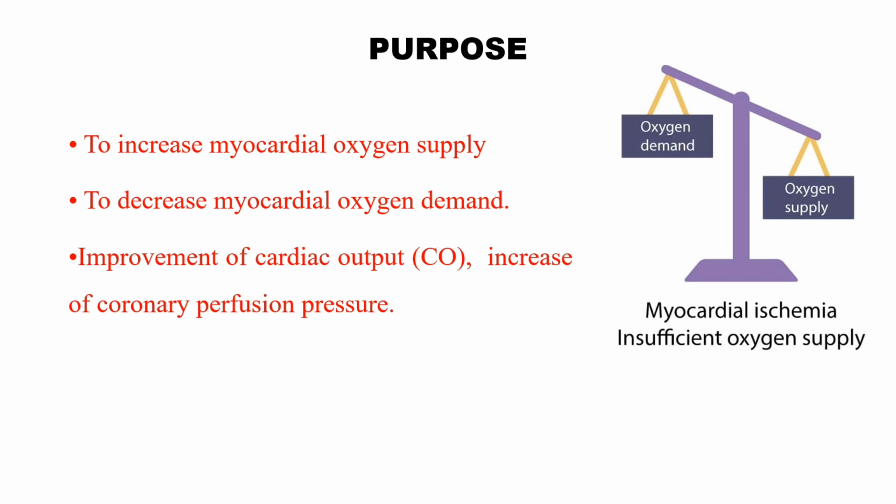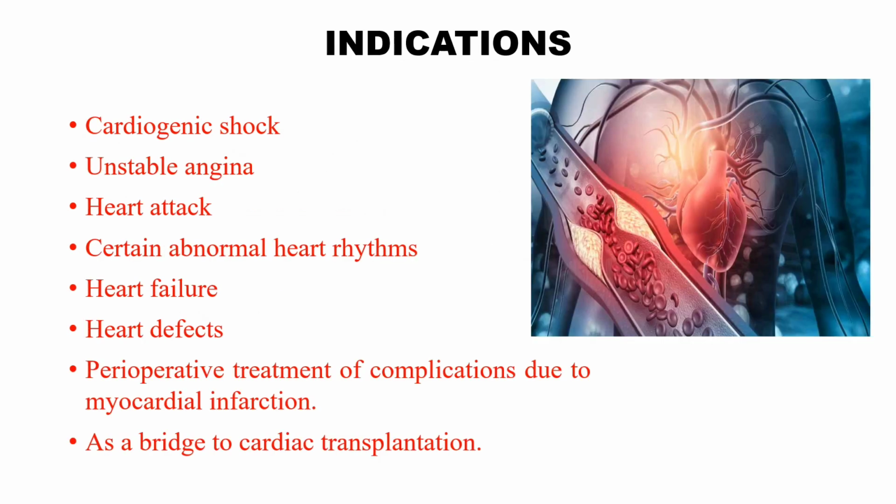Coming to the purpose. The primary goals of intra-aortic balloon pump treatment are to increase the myocardial oxygen supply, decrease myocardial oxygen demand, improve cardiac output, and increase coronary perfusion pressure.